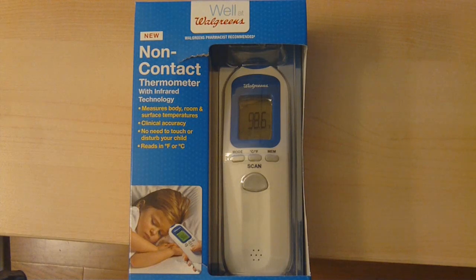Hello viewers, welcome. This video I'll be showing you the Walgreens non-contact thermometer.